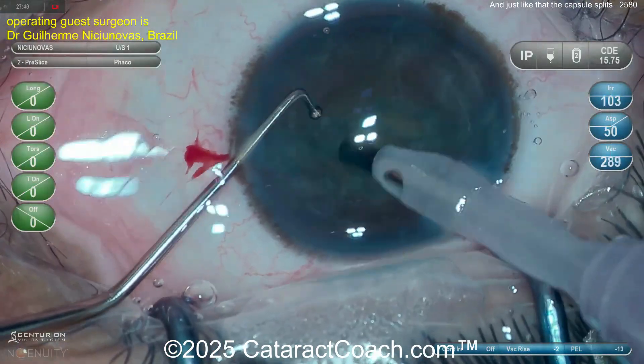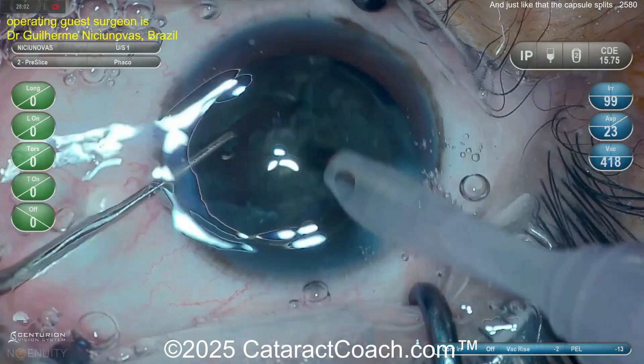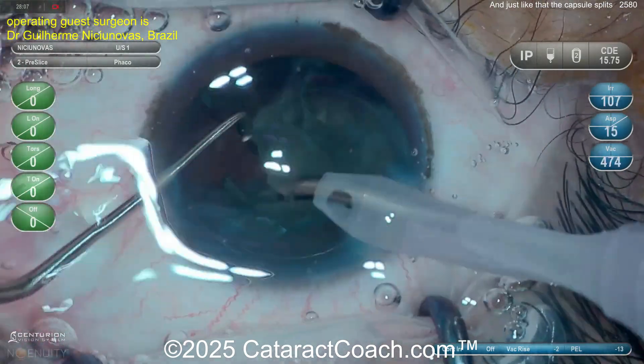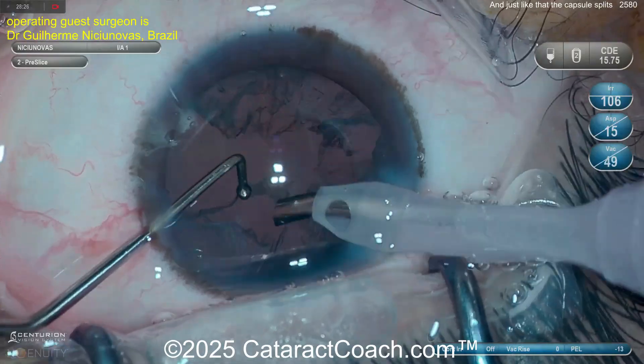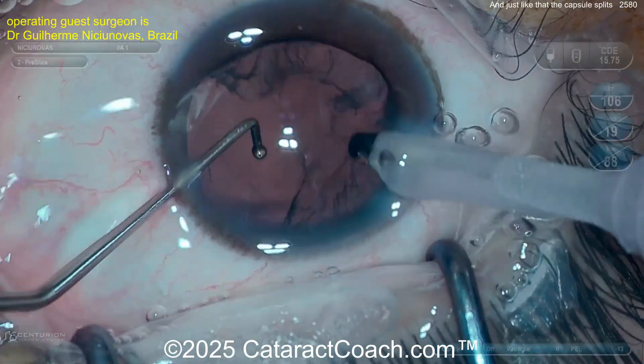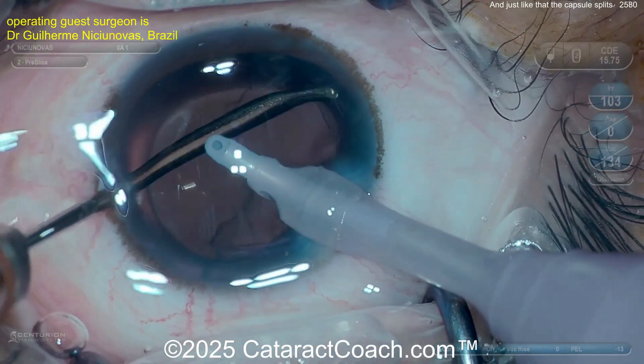The lens is pretty soft in this case — young patient here. We aspirate this out, and the nucleus gets vacuumed out pretty easily. Nice and soft — a Beverly Hills cataract right there. Get the whole thing down, and now we're going to do some cortex removal.